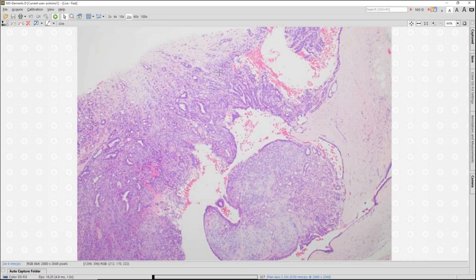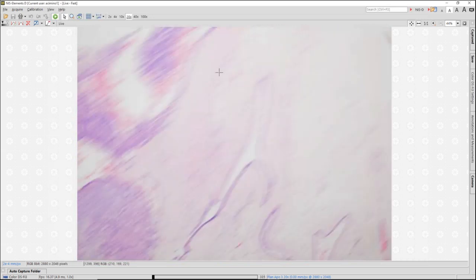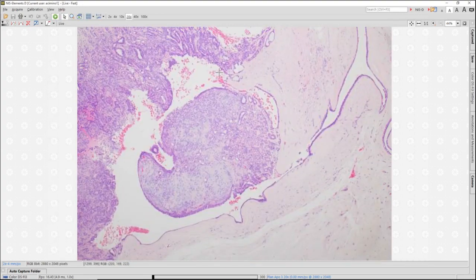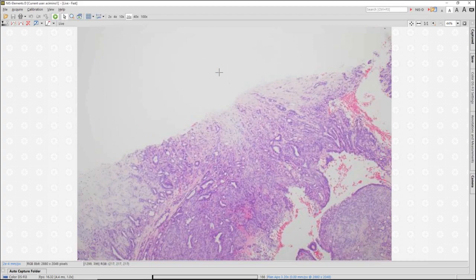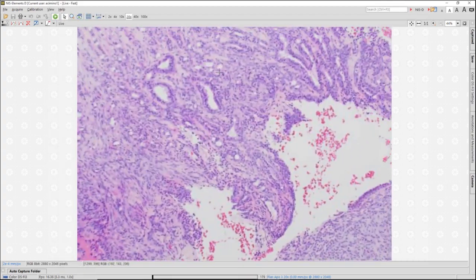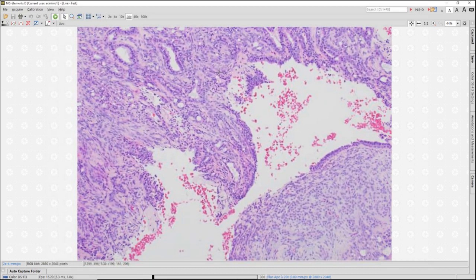Here's a core needle biopsy of a lesion in the breast. We see that we're in a duct space, okay, that's my diagnostically useful clue. Dilated, lined by bland, flattened epithelium, and I have a proliferation projecting into that space. In some areas, I see what resembles more conventionally an intraductal papilloma with adenosis. All of these glands within the fibrovascular core.